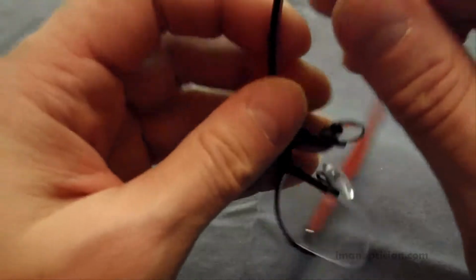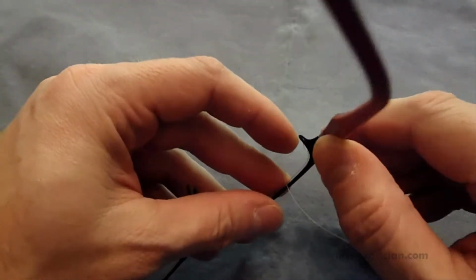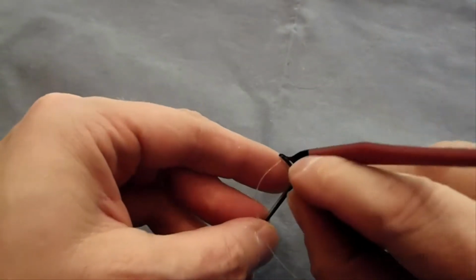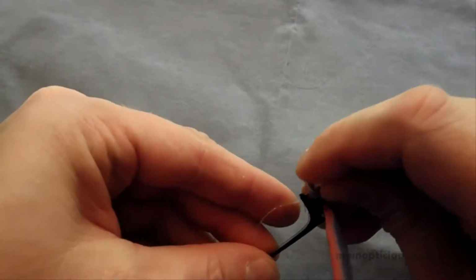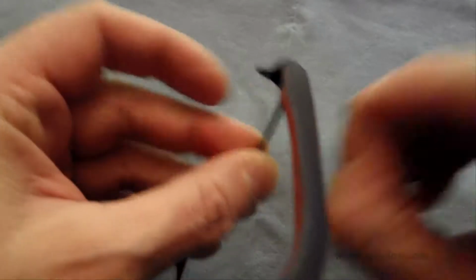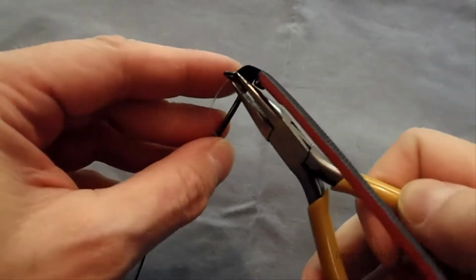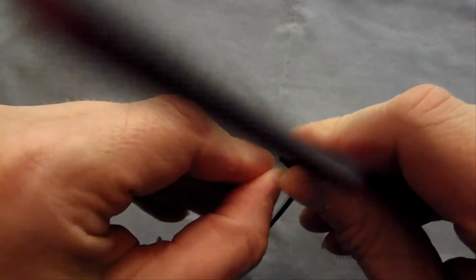But when they're a little bit old, sometimes it's cut off here. You can't get quite at it, so you're going to use your pin, and you can just get into this little loop here on the inside and pull that straight out a little bit, and get on it with your needle nose pliers and pull it out. I don't want to take a chance on wrecking this new frame, so I'm just going to push that. And then we got that clear.